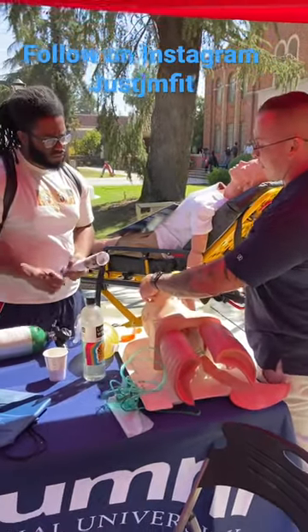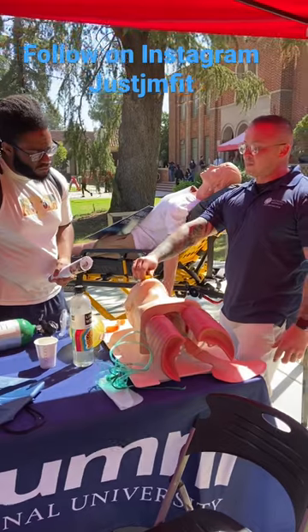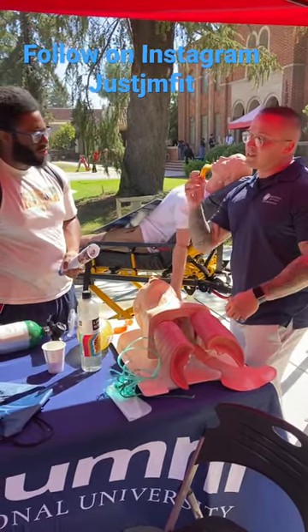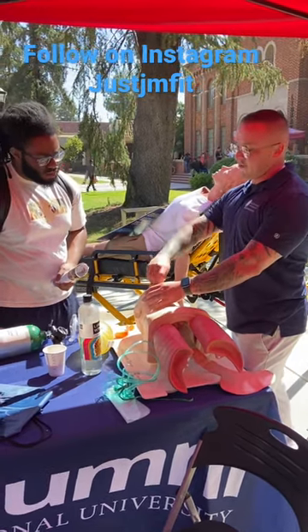And then the way you put it in — you put it in the side. When you're about halfway through, then you flip it. You don't want to go straight in because if you go straight in, you're going to push that tongue back and create an obstruction. So you want to go like this, halfway in.